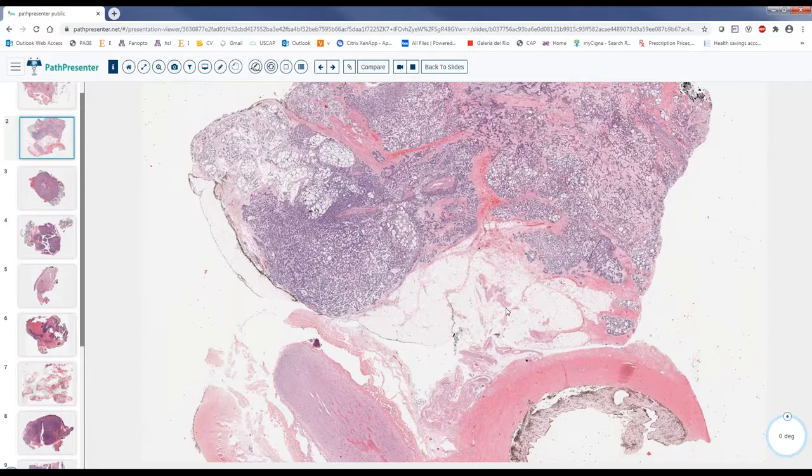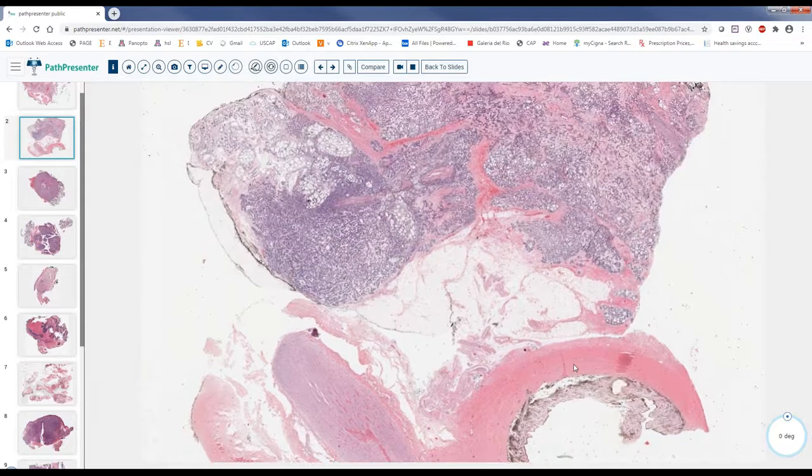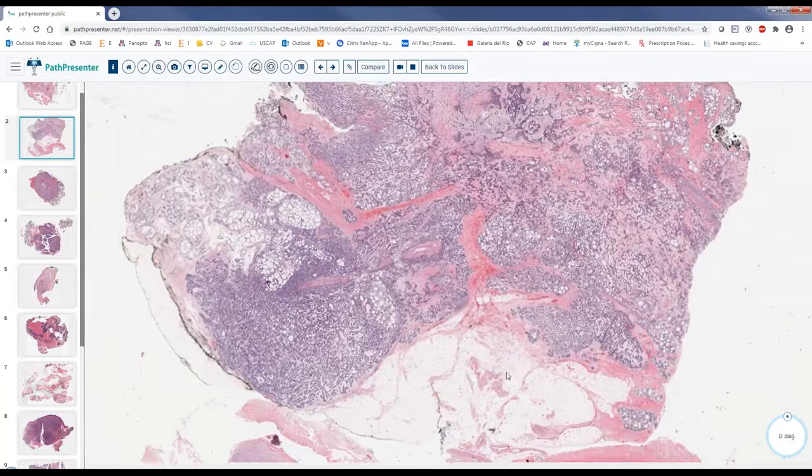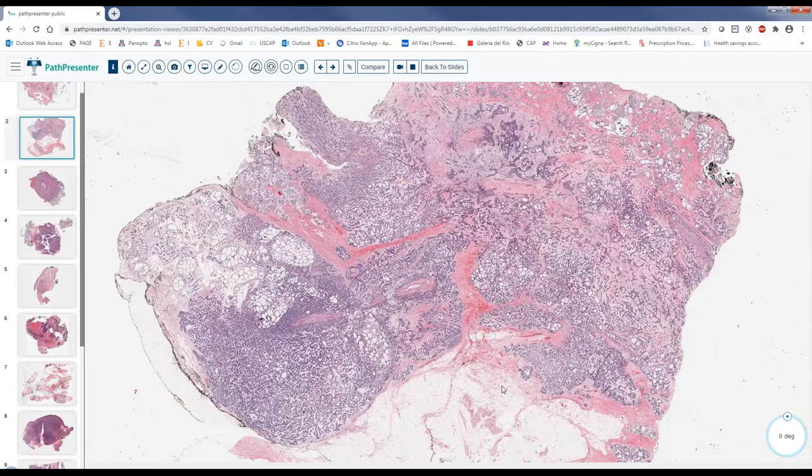Okay, so it is bad from the beginning, while they are doing this radical resection, it looks like a bad tumor. So when we give you some slides, try to assess where you are first and try to assess the situation and how they are creeping into what vital structures surrounding them. Okay, all right, so let's see here. In low power, anybody can show the diagnosis, and then we will be describing any differential diagnosis.